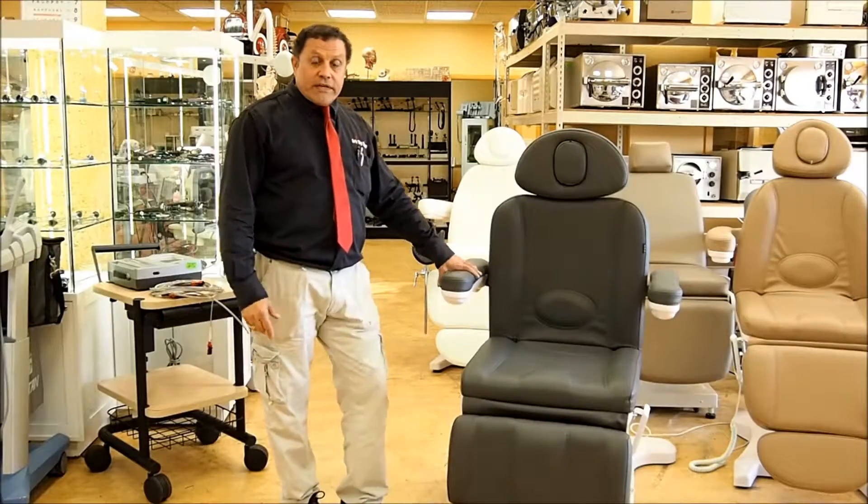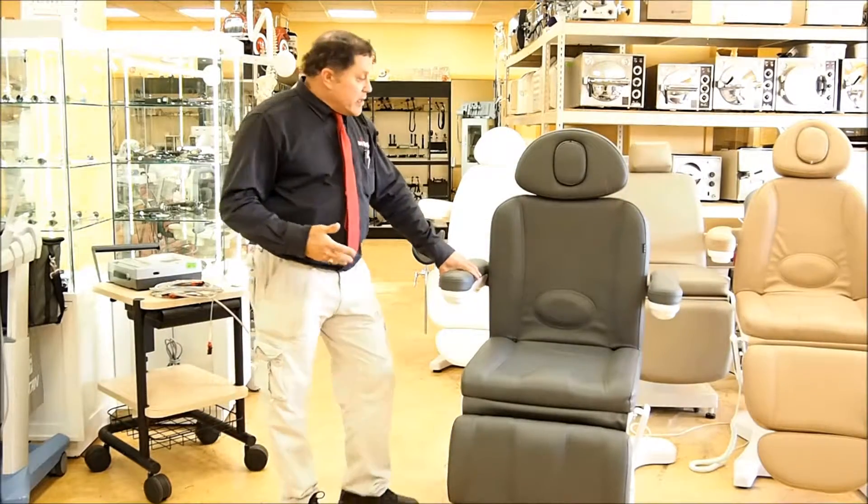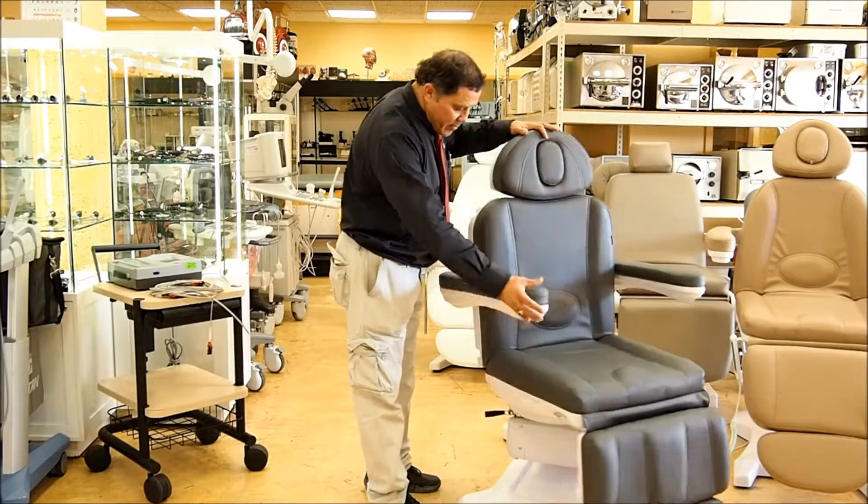Hi, I'm Rob with the Doctor's Toy Store and these are the new DTS chairs. They're just in. We have several different models.